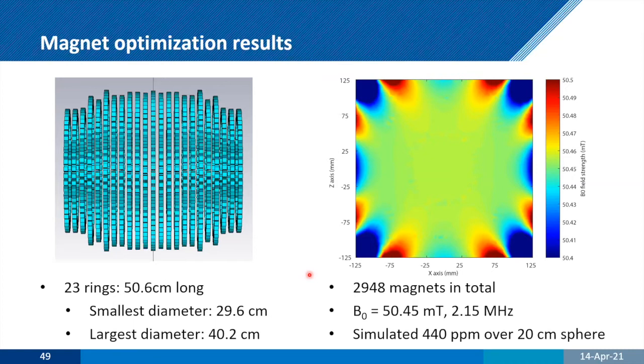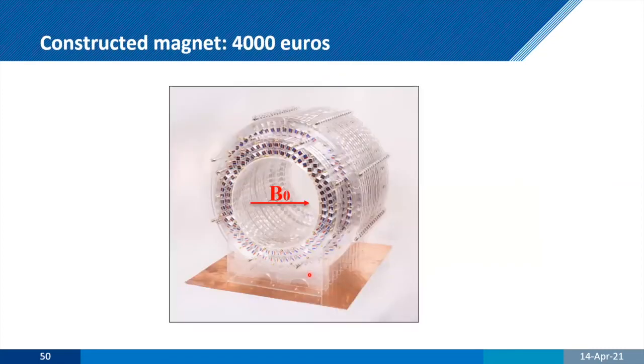But a lot of the hardware that they've developed is useful for considering how we're going to design things. So the magnet here is constructed. You see the B0 field is transverse, which means as we design RF coils and gradient coils, we have to take that into account. And for the gradient coil, it's going to give us a slightly different approach to what we're using in terms of the target field.